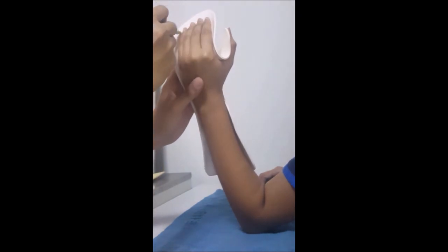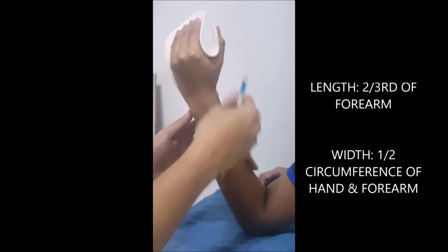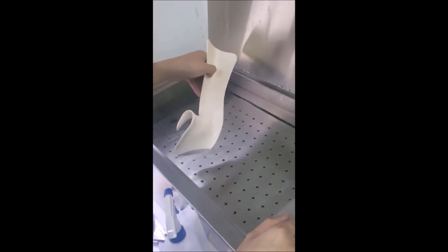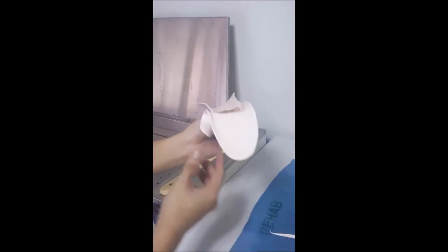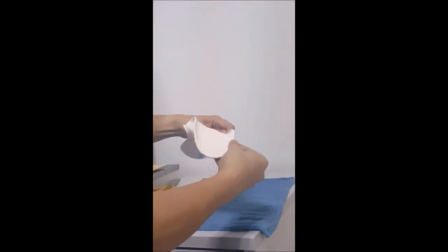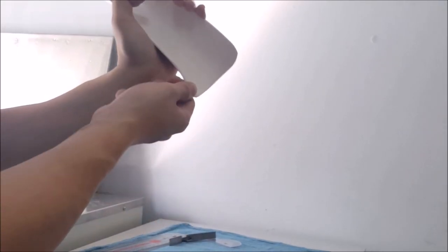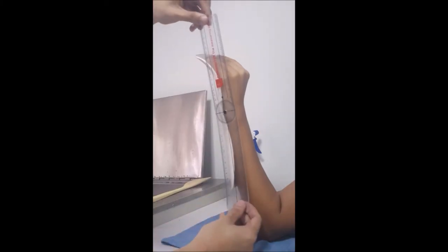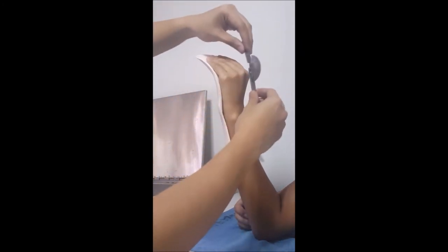Now check the fit of your splint. Remember, the length is two-thirds of the forearm and the width is one half of the circumference of the hand and forearm. Submerge and cut the area that needs trimming. Make sure to maintain the smooth edges of the splint. Proximal end should also be flared. Use goniometer to check for the joint positions. But if you're competent enough, the use of goniometer is optional.